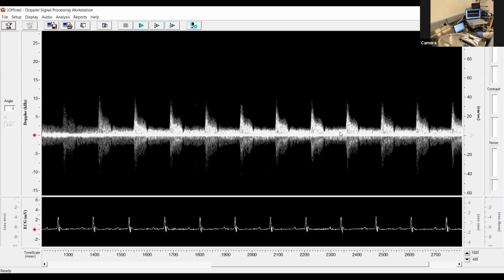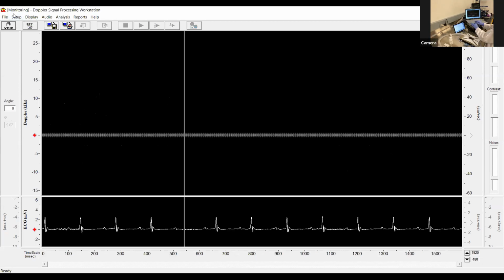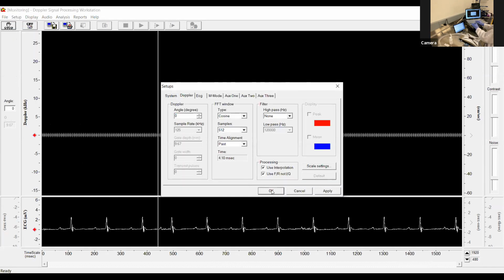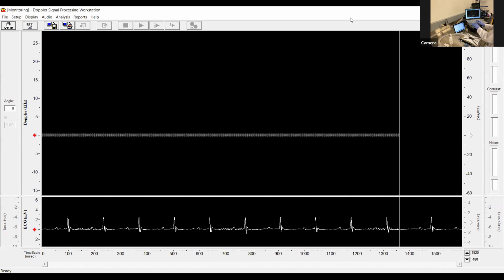Yep. Okay, so pulse wave velocity is basically measuring how fast the pulse of blood is flowing through the vascular tree. So we can relate back to arterial stiffness. If the vessels are more stiff, then the blood pulse is going to travel faster.